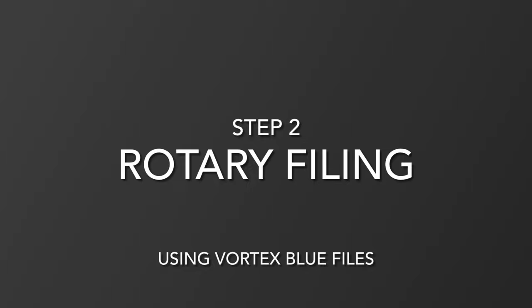Now that you have established the glide path using hand files, you will use Vortex Blue rotary files to clean and shape the rest of the canal.